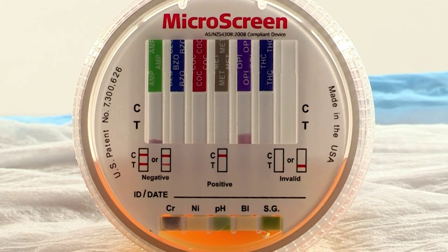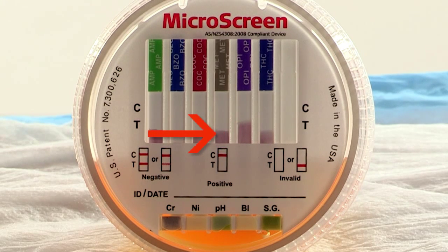Now you can see the urine is migrating into the bottom of the lid and starting to move up the strips, which are blank to start with. You can see a pink line moving up the strips.